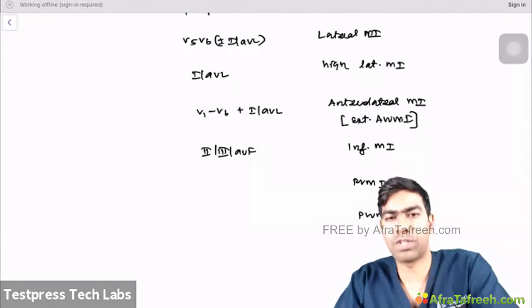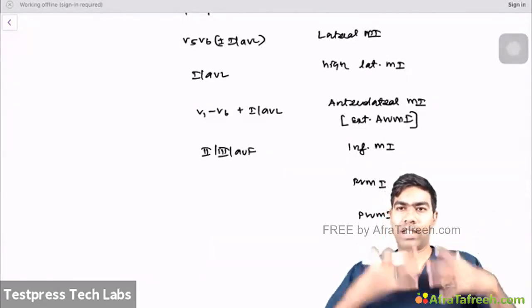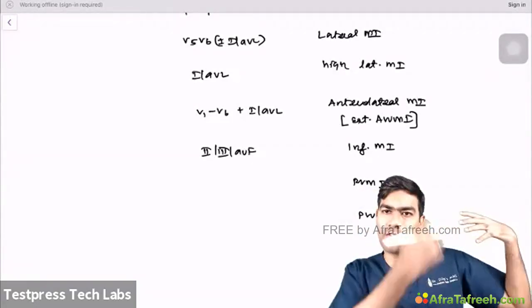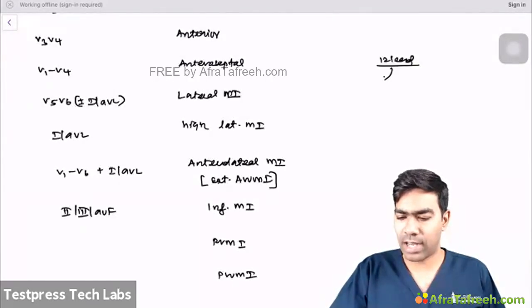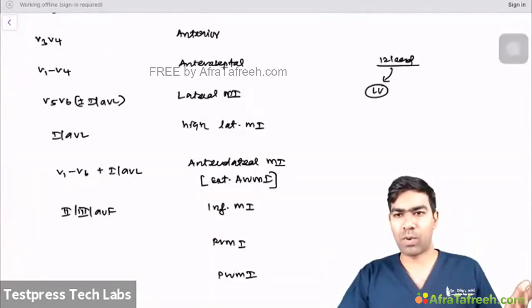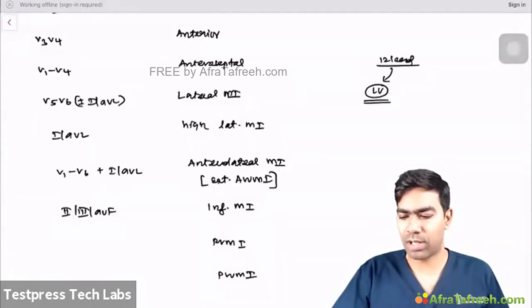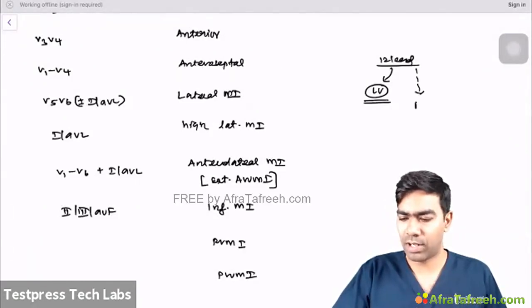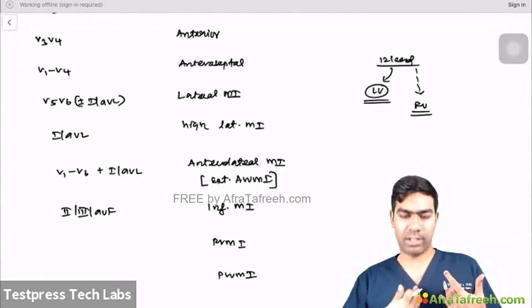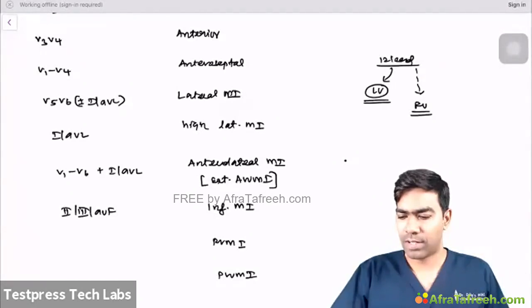posterior wall properly. Suppose you see where the leads are placed, they are placed on the anterior wall of the chest, and the frontal plane leads are also mostly concentrated on the left side. Which means whatever 12-lead ECG system we are seeing, it's designed to see the left ventricle in and out. They see the inferior wall, the lateral wall, a lot of areas, but the left ventricle is the one that is seen very properly. But there are other areas which are not seen properly at all. Let us assume the right ventricle has a very poor view. For example, only V1 has some view of the right ventricle, but apart from V1, nothing else has the right ventricular view properly. This is a very important pitfall.